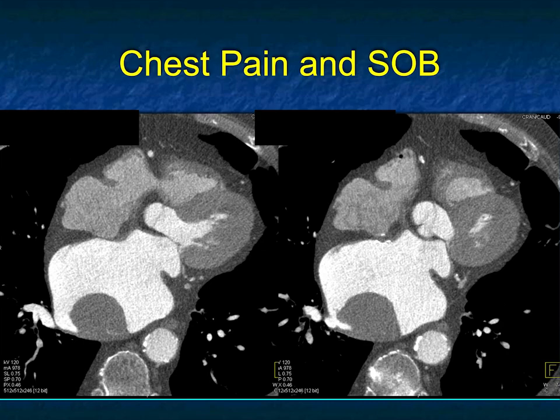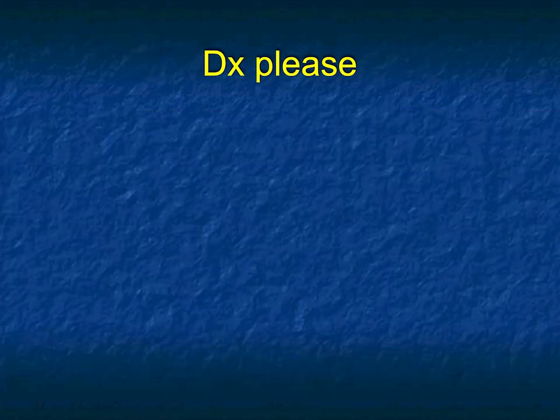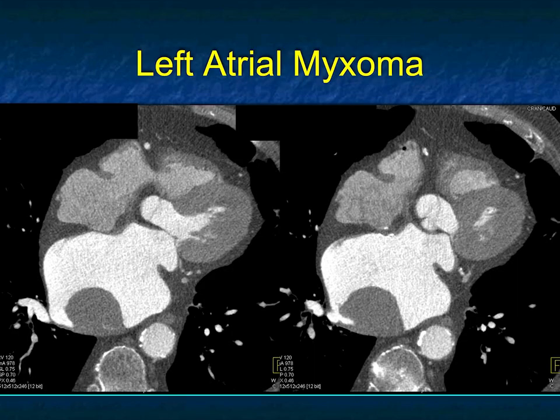What about this case? Chest pain and shortness of breath — nothing tricky. There's a mass in the left atrium; it's posteriorly placed and there's no calcification. The most common tumor is an atrial myxoma, more common in the left atrium, which is where this is — usually near the fossa ovalis, though not necessarily in this case. It doesn't have the look or the irregularity of a thrombus, and thrombus is also seen in the right or left atrium where a catheter has been placed. This was left atrial myxoma — that's the best diagnosis.